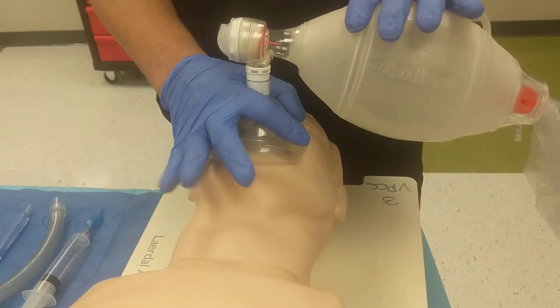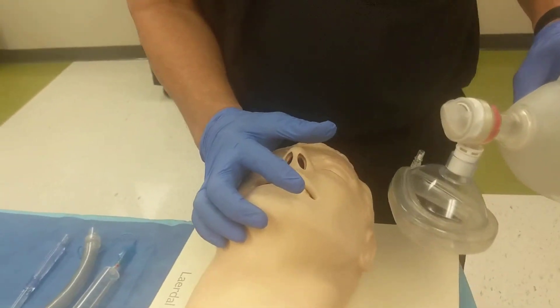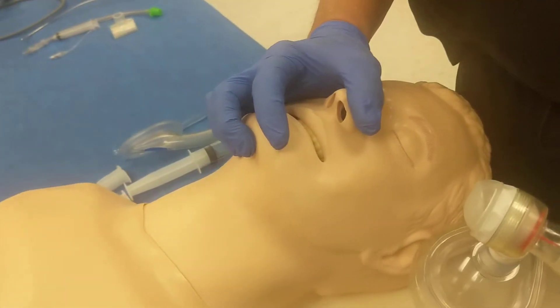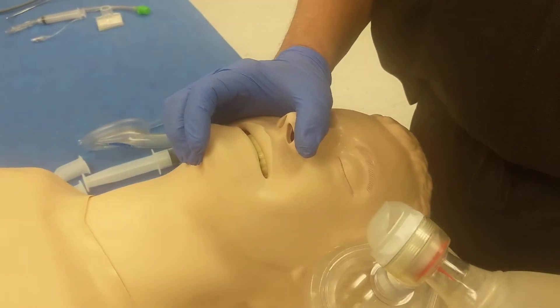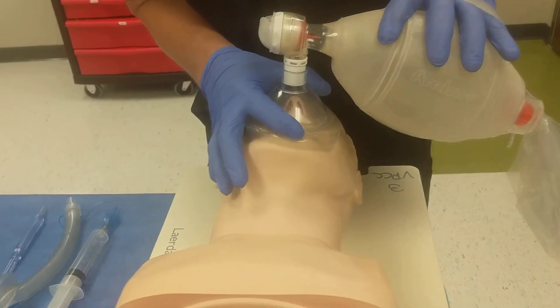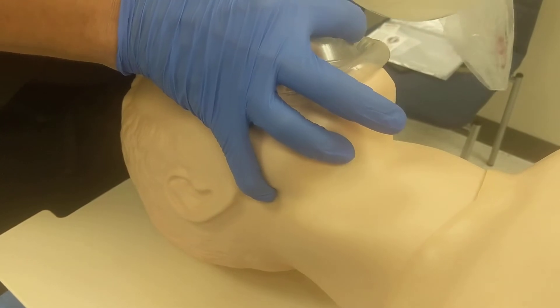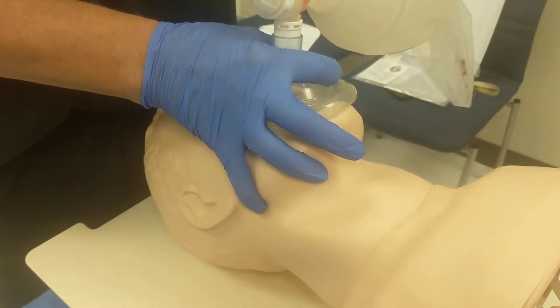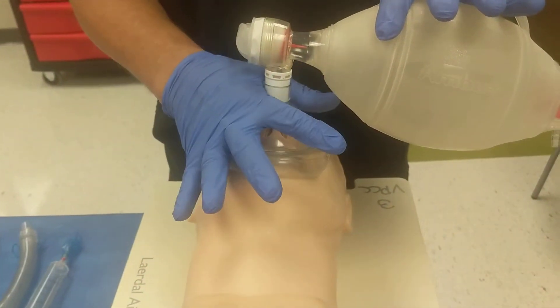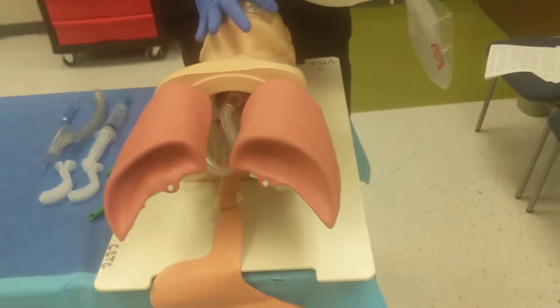My suggestion is: if you have your fingers across the mask and you're trying to ventilate the patient and pulling with those fingers, you can close the patient's mouth and essentially close their airway. If your hand is big enough, or the patient's face is small enough, you may be able to take your fifth and fourth fingers, wrap them around the mandible ramus, and actually pull forward — that can help seal. But it's a difficult maneuver, particularly with a large face. The main maneuver is to get that web all the way up against the nozzle and push straight down. You can easily ventilate using this technique with just two fingers.